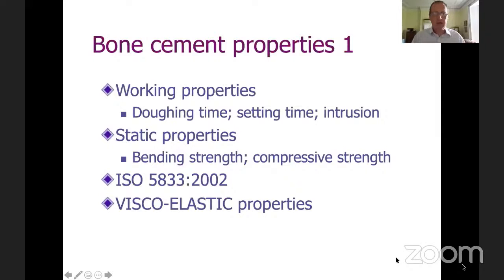So if you as a surgeon, the things you're interested in are what we call the working properties. You want to know that when it's handed to you by your scrub nurse, that it's gone through its doughing time, you can work with it, you've got plenty of working time so you can get your implants in before it goes off. But you also don't want it so sticky on your gloves that you can't work with it. Next, you want to know that it's reliable. It's got reliable static properties that mean it's strong enough. It's able to put up with the mechanical forces that will be sustained in day-to-day activity.